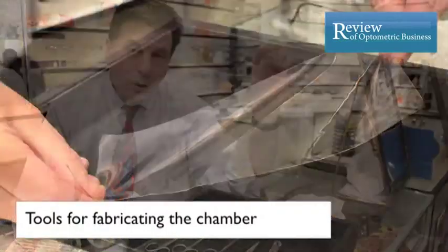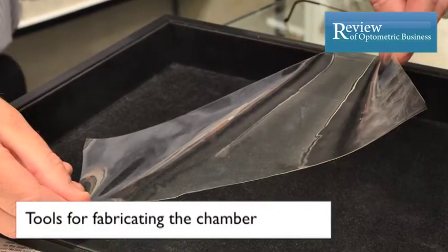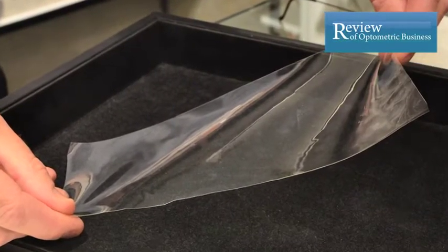This is a single sheet of a moisture chamber panel. From this we produce a pair of moisture chamber glasses.